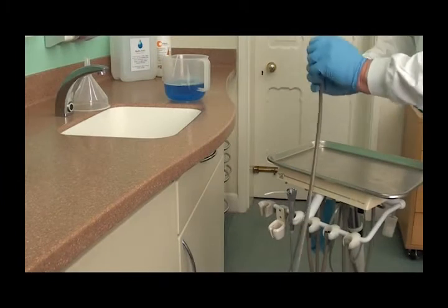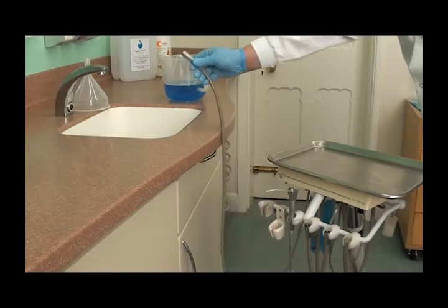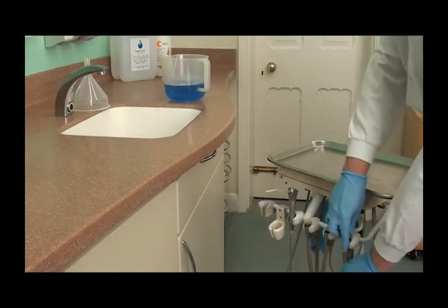Purge all the remaining blue solution through the unit. Depressurize the bottle, remove from the unit and rinse along with the jug and funnel.